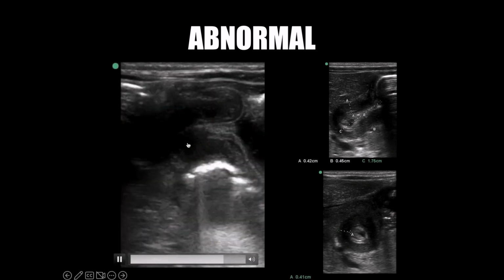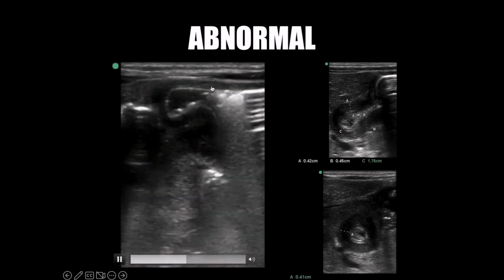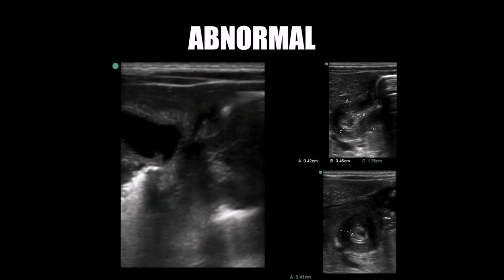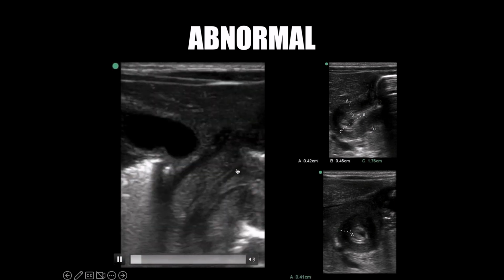You actually see your gallbladder coming in on the top left here. You've got some liver popping in. Gastric body is up here. You've got some hypoechoic content and then some hyperechoic air sitting here in these least dependent areas with that dirty shadowing coming down. Again, take your freeze frame, pause that.